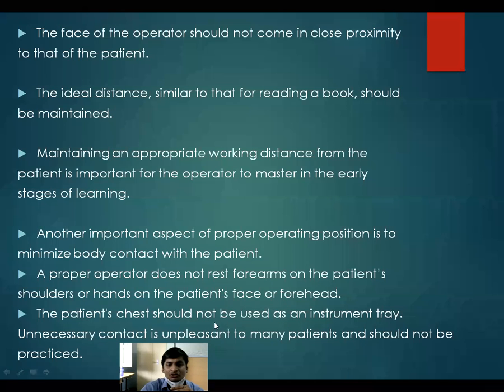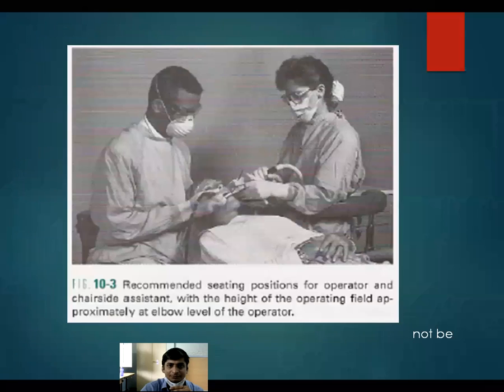The patient's chest should not be used as an instrument tray. Unnecessary contact is unpleasant to many patients and should not be practiced. Many a time while performing different positions, the operator will use the patient's chest as an instrument tray. It should be strictly avoided, as this unnecessary contact is unpleasant to many patients.